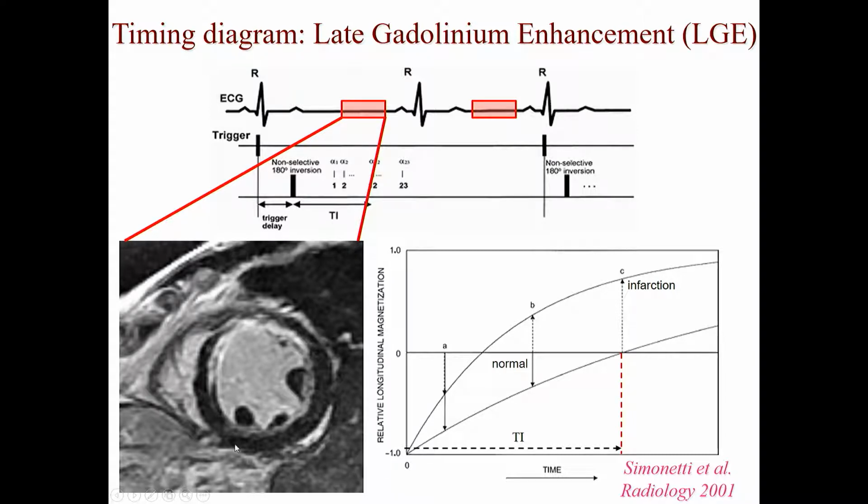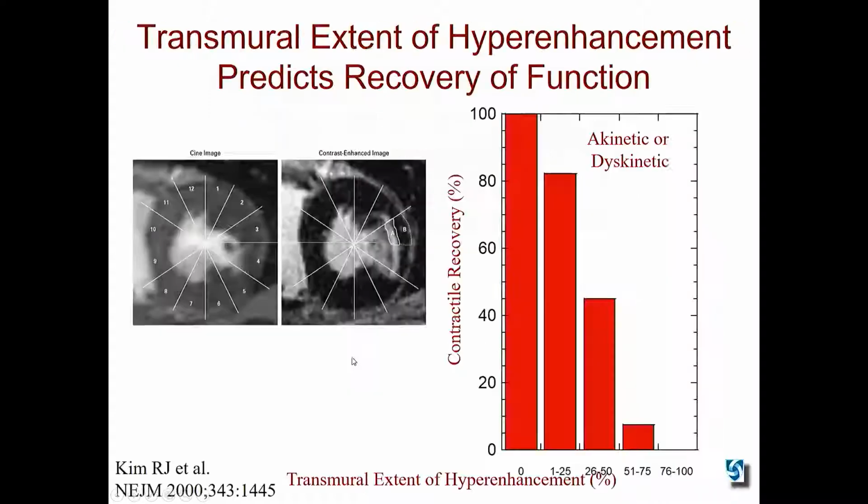This technique does so by, again, using some specific technique to bring out the contrast between the myocardium and the infarcted tissue, so-called inversion recovery, to draw out the difference between these two structures, and taking the image in the quiescent part of the cardiac cycle, in mid-diastole. It will allow us to freeze the heart without blurring to generate this picture. Why is this type of technique, LGE technique, useful?